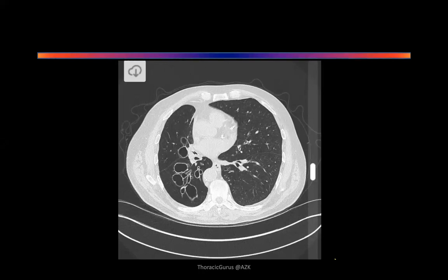Okay. What is proximal? Any description you want to do of proximal something happening? What is this area? Can you see this? There are multiple. Probably there is some lesion which is obstructing the airway. Or is it peribronchial? It's peribronchial fibrosis. Yeah. Okay. Anything else you want to describe, Vikas?